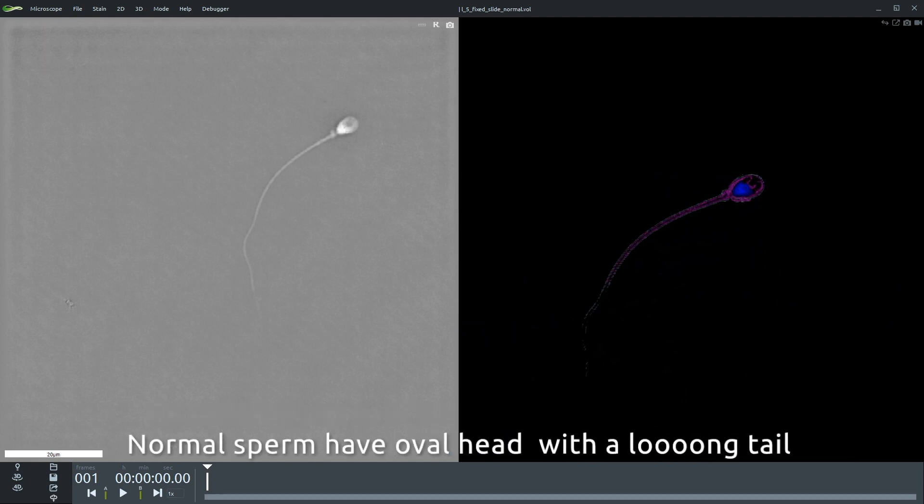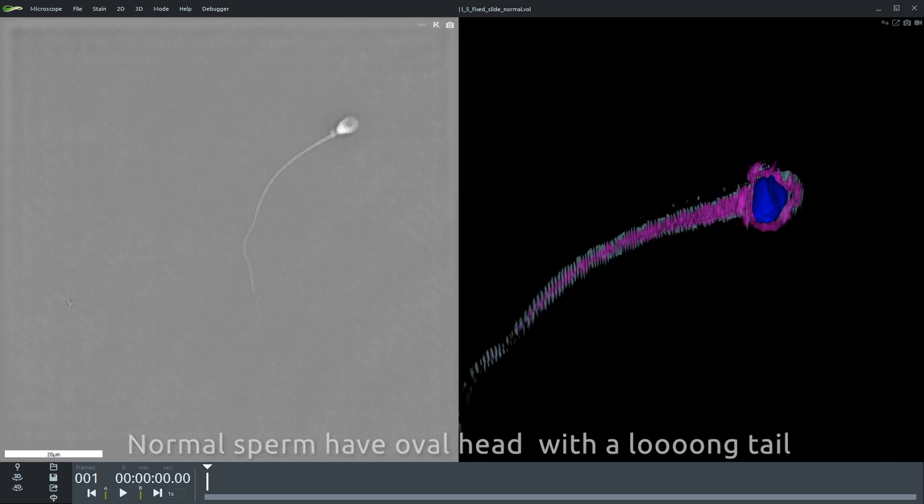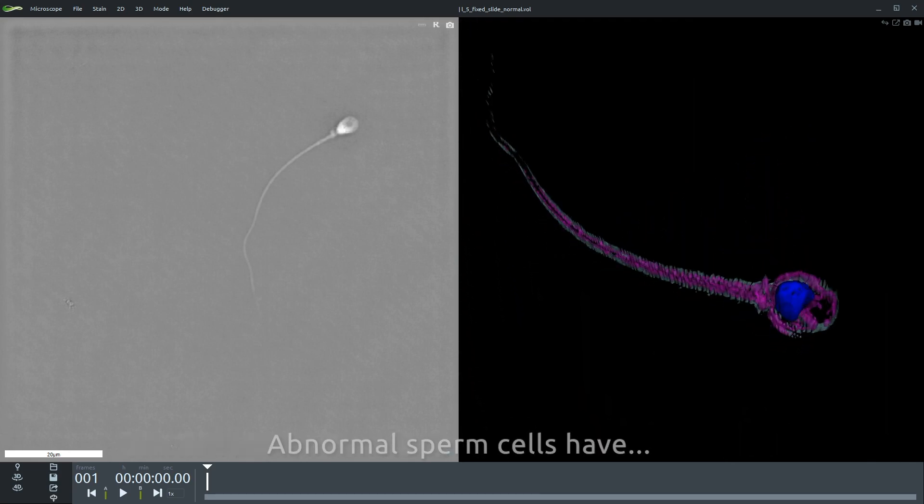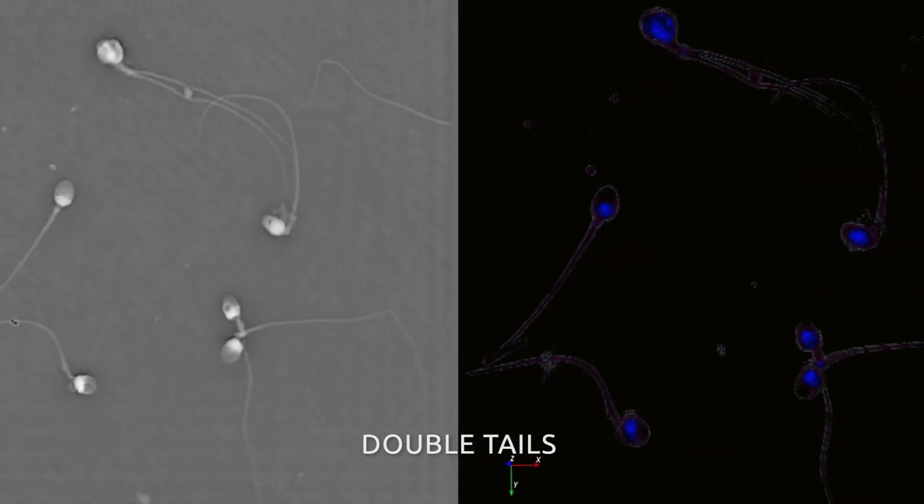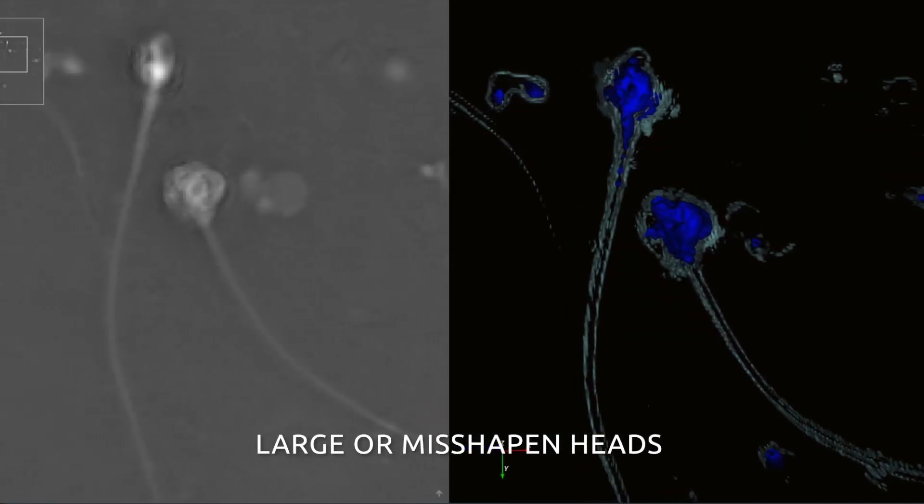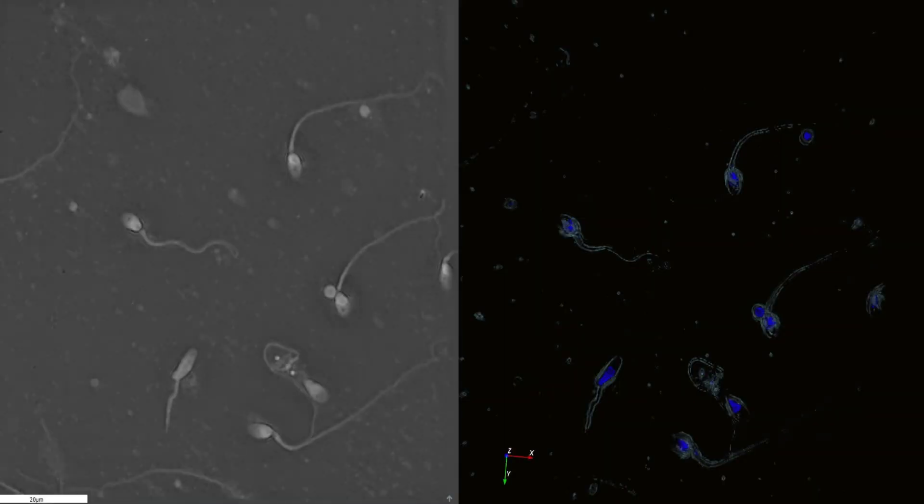Normal sperm cells have an oval head with a long tail. Abnormal sperm cells have double heads, double tails, large or misshapen heads, and a variety of other horrible defects.